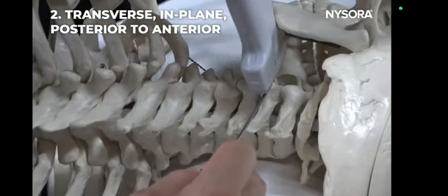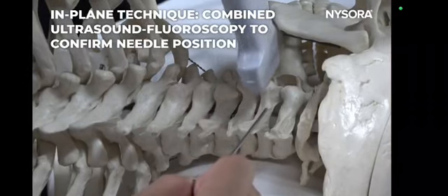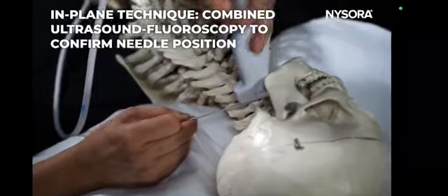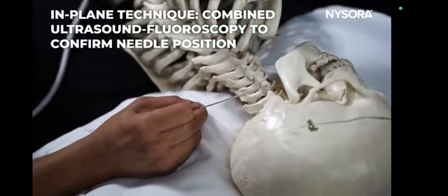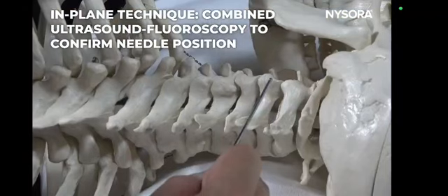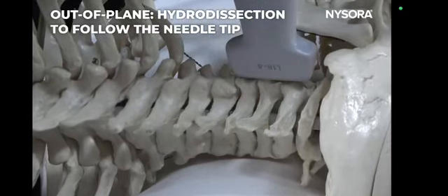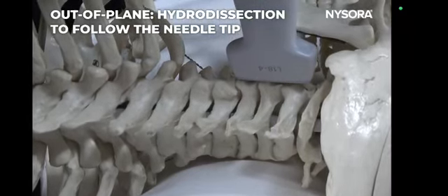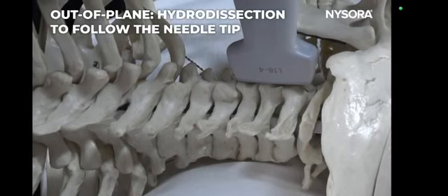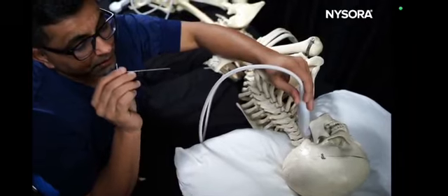This is the same technique that you can use to perform radiofrequency treatment. So you will do an in-plane technique, you put your needle under ultrasound guidance, and then you do an X-ray. I call this the combined ultrasound fluoroscopy technique, or CUFF technique. When you talk about the out-of-plane technique with the longitudinal approach, you have to use hydrodissection to make sure you chase your needle tip.